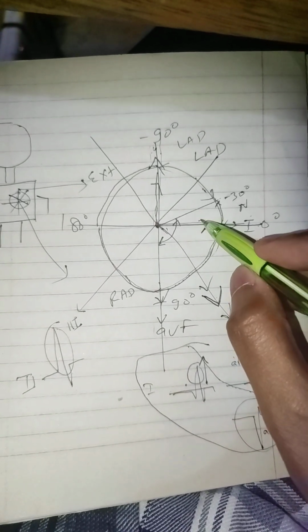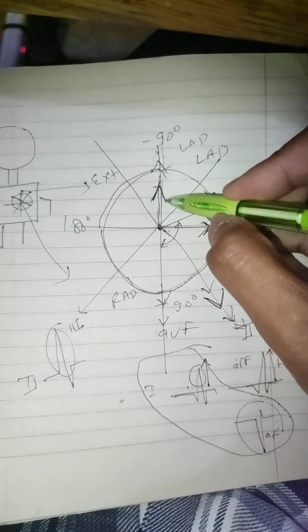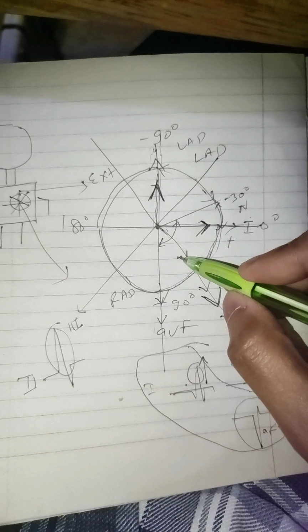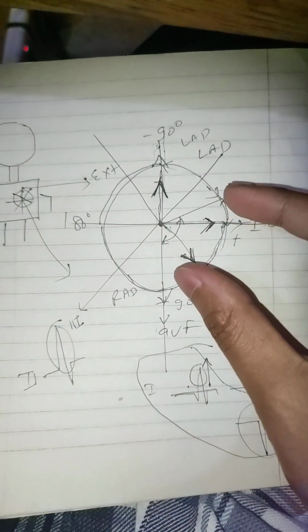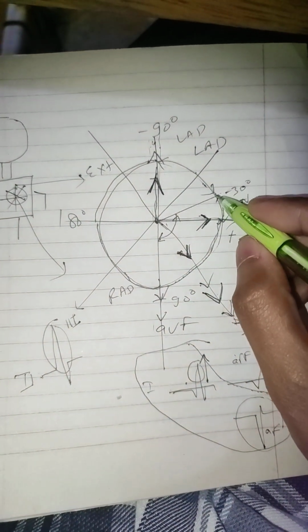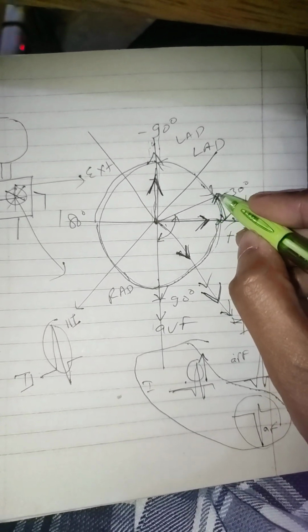So here you can see one vector is going in this direction and two vectors are leading towards this side. So most likely the axis of the heart will be in this range only. It won't go beyond this.